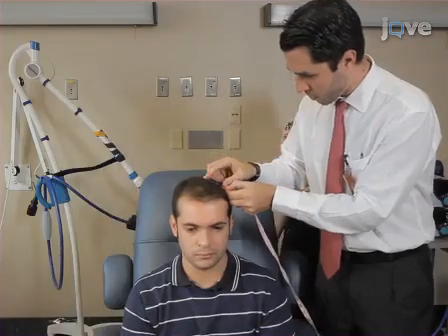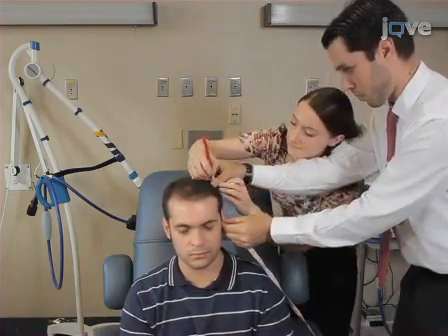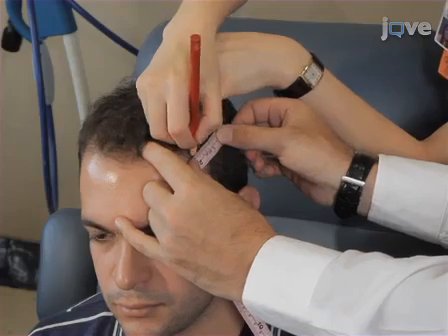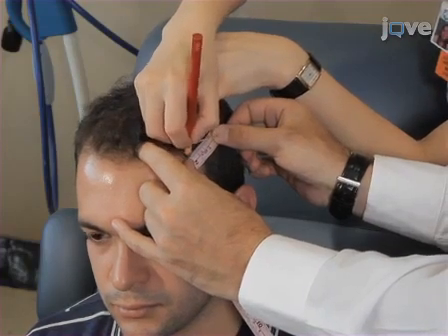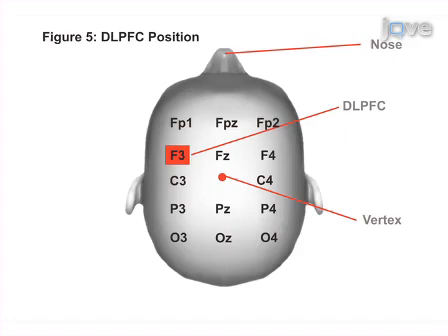To locate the primary motor cortex, or M1, calculate 20% of the auricular distance and measure this distance from the vertex along the auricular line. This spot should correspond to the C3 or C4 EEG location, which is the location stimulated in this video. To locate the dorsolateral prefrontal cortex, measure 5 cm forward from the M1 location; this should correspond to the F3 or F4 EEG location. This method is sufficient when using traditional TDCS electrodes. For more focal TDCS, other methods of cortical localization such as neuronavigation may be needed.